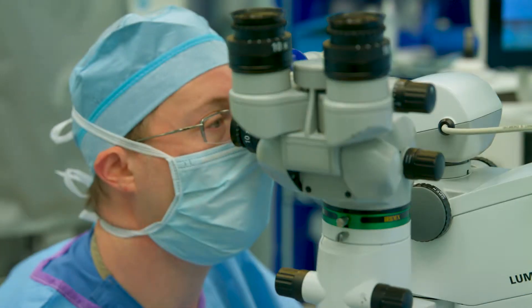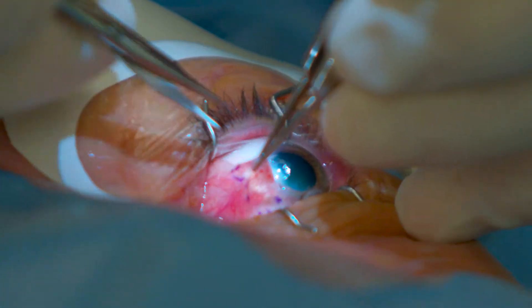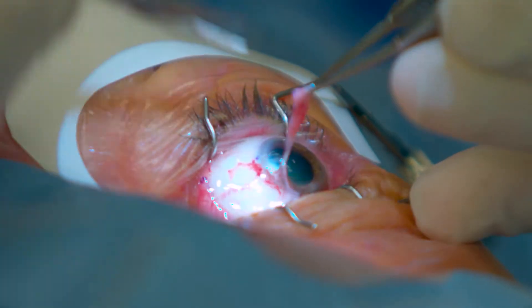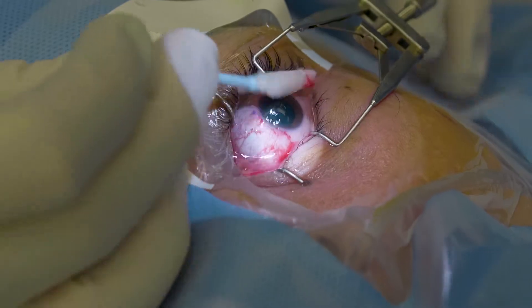Once we remove the leading head, I want to do that in a manner that's not going to create any type of thinning — an area of defect adjacent to a raised area, which is a complication of pterygium surgery or removal of any growth that extends over the cornea. Then we want to remove it posteriorly; addressing anterior Tenon's tissue is key as well to decrease your recurrence rate.